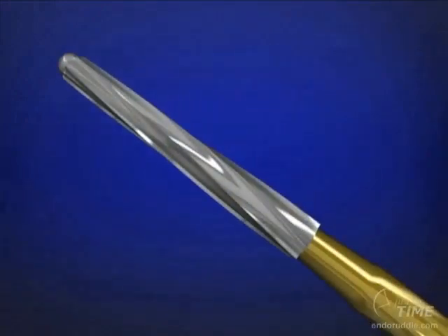The Endo-Z burr is an important burr in that it is safe-ended. It is the number 1 burr in dental schools in North America because students can put the end of the burr on the pulpal floor in a furcated tooth. They can move around the access cavity and cut laterally to clean up the axial walls and flatten them. I personally, I should say, don't use the Endo-Z burr because I prefer a burr that not only is lateral cutting but end cutting as well.